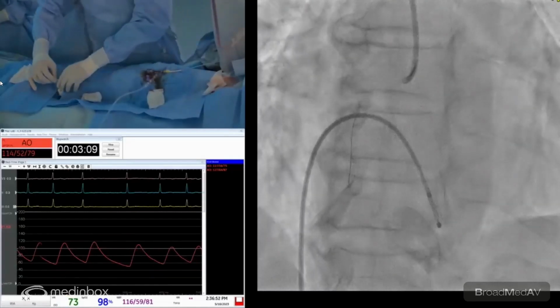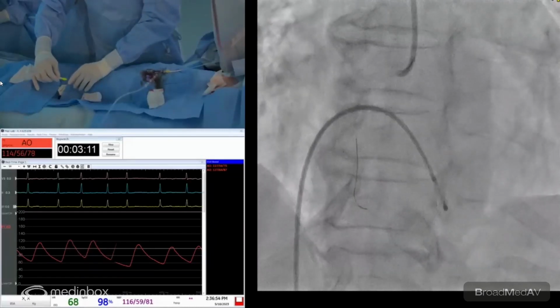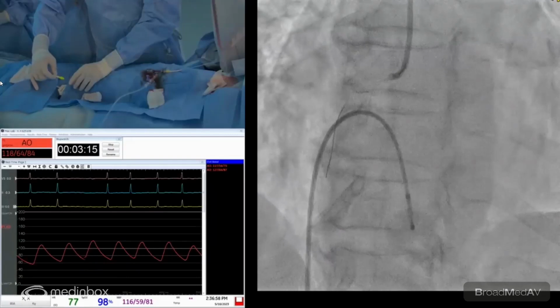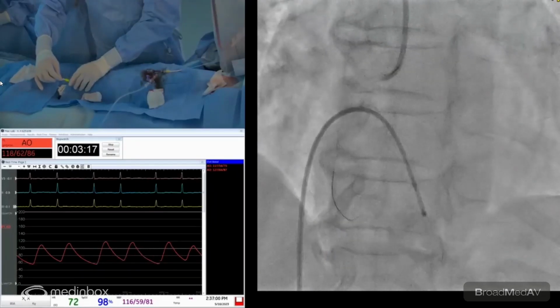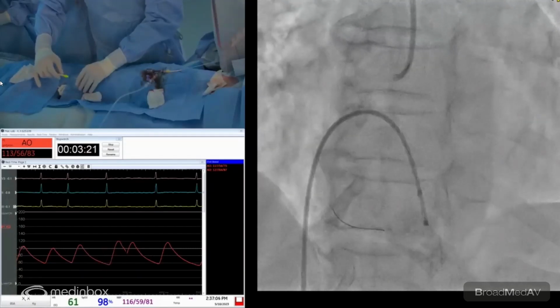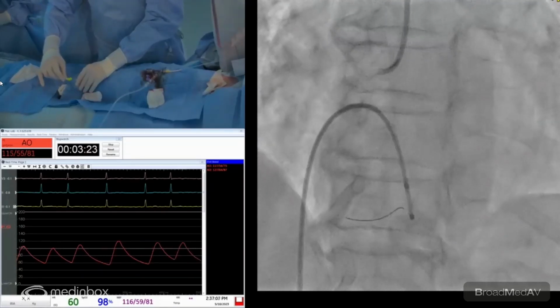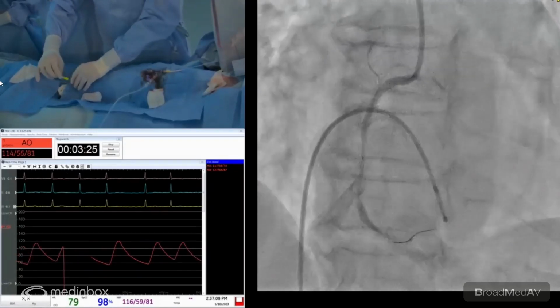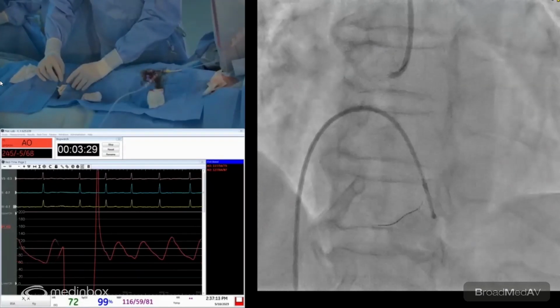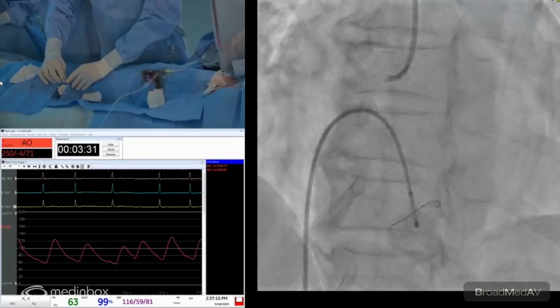No, I agree with you. The floppy wire or the Viper wire for the orbital are quite difficult to get around with. So when the calcification looks just a little bit hard to cross, it's always a good intention to try with a workhorse wire we are used to. We put it on a microcatheter up front, and then that makes things much easier afterwards.